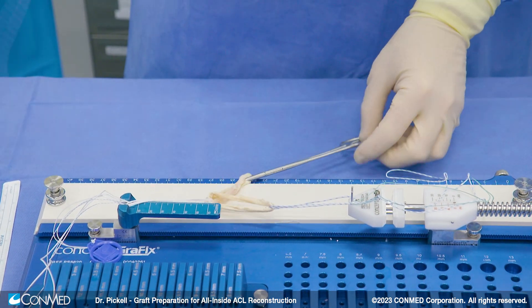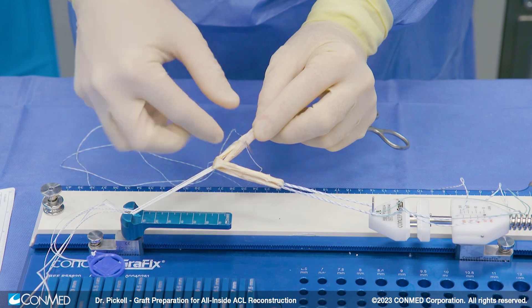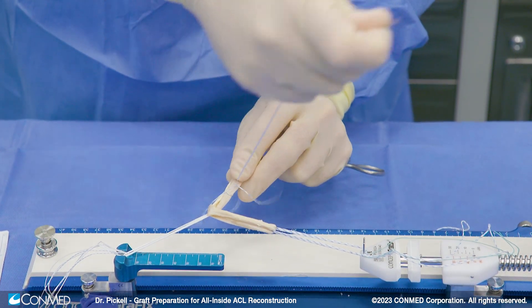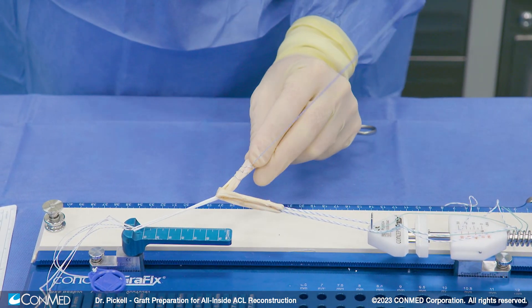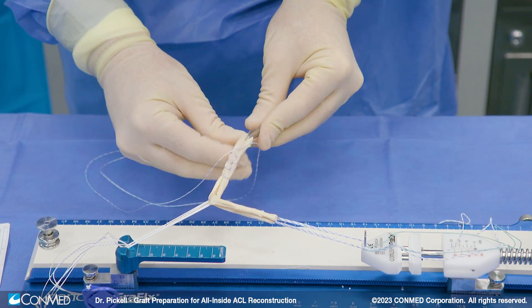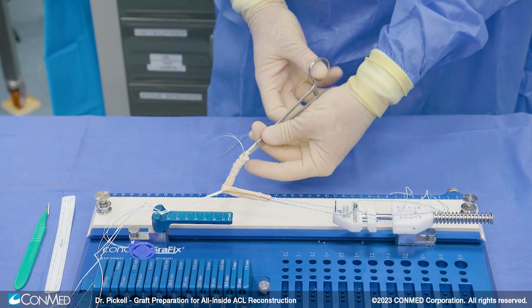The next thing we're going to do is take our loop suture and pass the two ends through the loop. That's going to start our securing of the graft, and then it's as simple as passing a whip stitch up and down. We're going to pass through both ends of the graft, retrieving it from the other side — there's our first secure loop. Pass the snap through the loop and this is how we make our whip stitch. We just continue that process all the way up the graft; I like about four to five passes — that's plenty. You don't need to cover the entire length of the graft with these sutures; it's really just to hold the ends together. The key is you want to make sure you're getting both tendon ends so that we're actually creating a whip stitch. Once we've done that, we just cut the needle off so we've got two free ends, and there's our graft tied together.